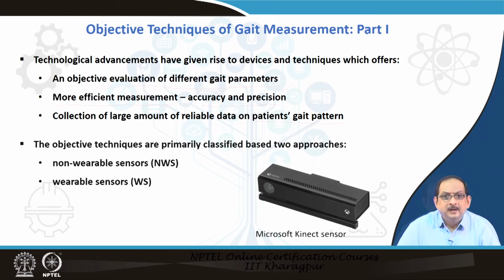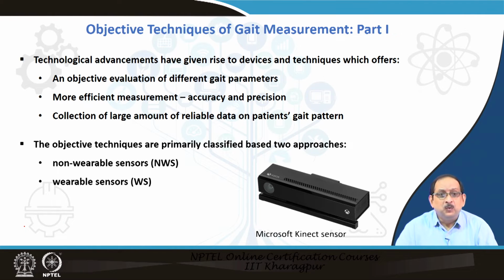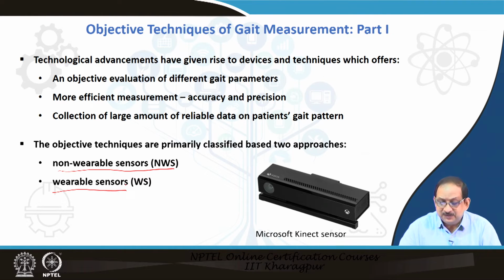The objective techniques are primarily classified based on two approaches. One is the non-wearable sensors, the other based on wearable sensors. On the right, you can see a Kinect sensor which belongs to the class of image processing system under non-wearable sensors.